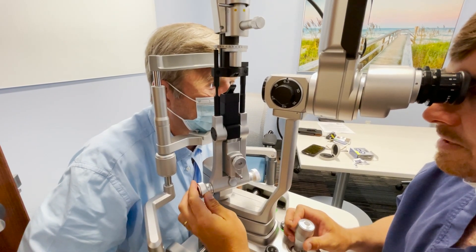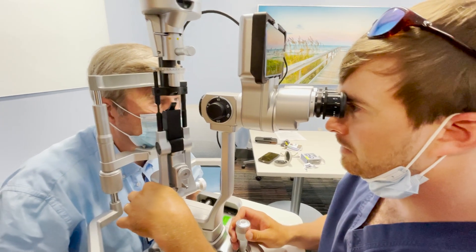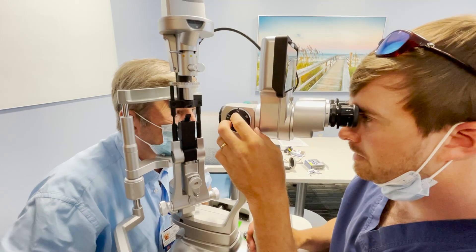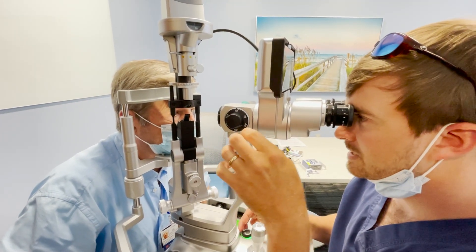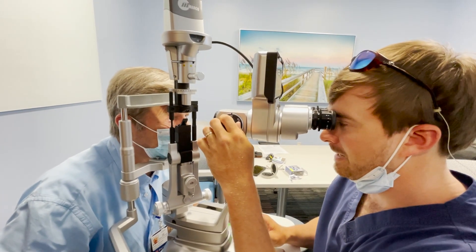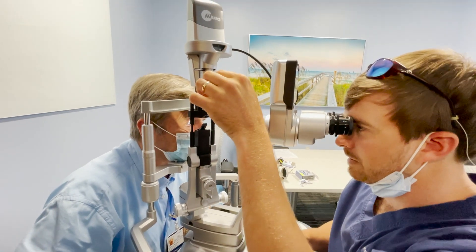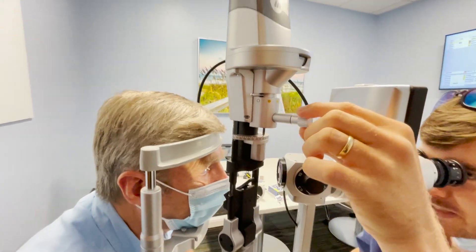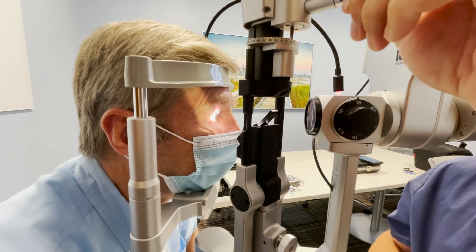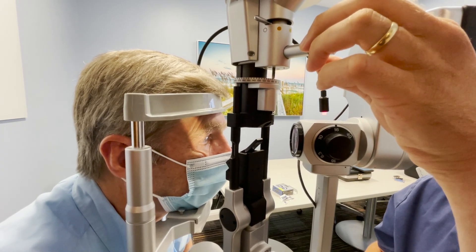A narrow beam is useful for looking at the cornea and its thickness, the limbus, and the cataract. It's also important for detecting inflammation — for someone with uveitis, you'd turn the light up as bright as it can go, magnify to 16x, and shorten the beam using this knob. You can lengthen or shorten the beam, which is important for measuring a corneal ulcer or corneal infection.